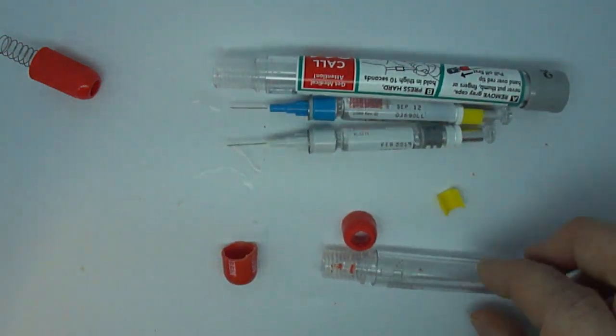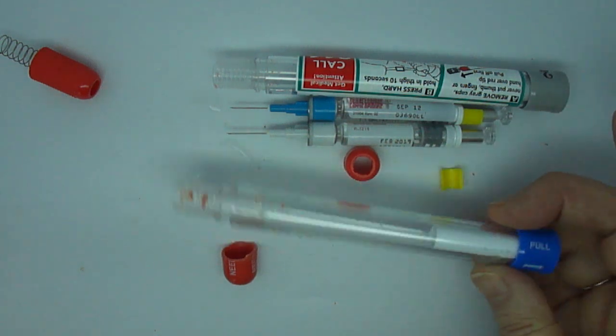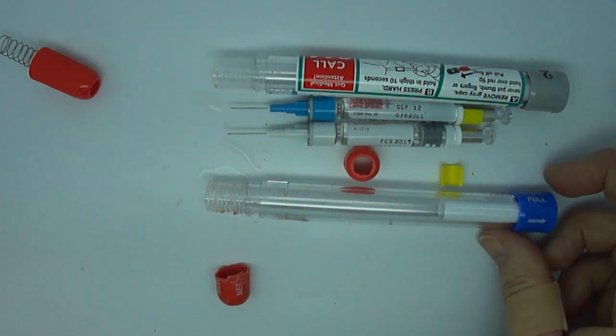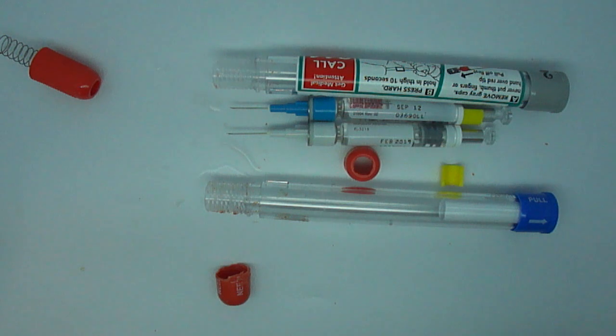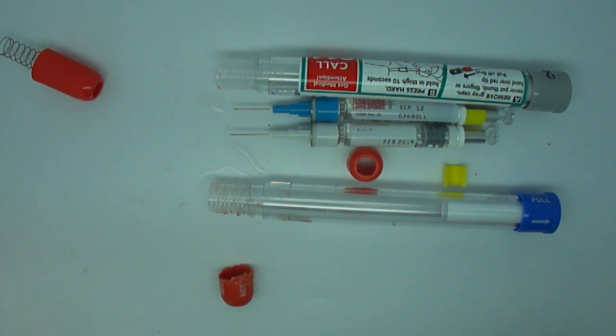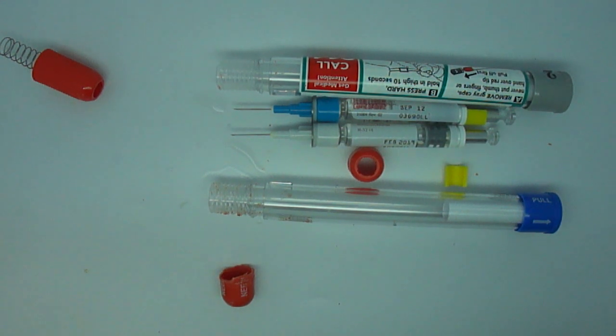So it's interesting that they have chosen to remove that option to access those additional doses. And I don't know if there were concerns that people were using it incorrectly, that they were trying to unscrew the cap before using the auto-injector for the needle dose, if they were not administering the additional doses correctly. But it does seem interesting that a minor modification seems to have been made that now makes it difficult to access those extra doses. So that's the end of this review.